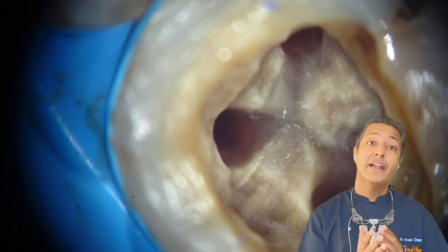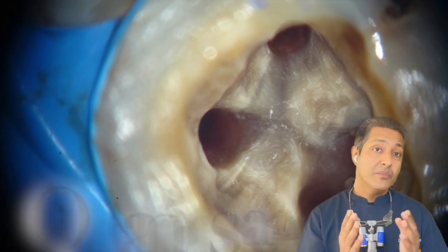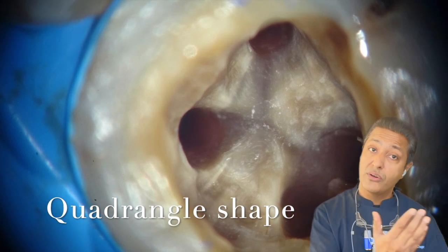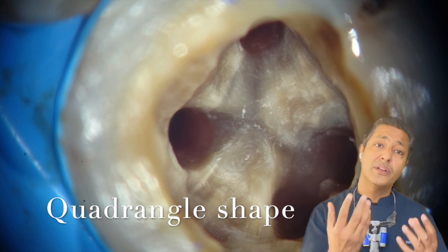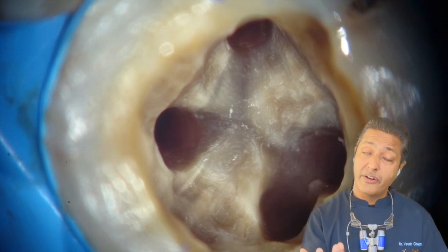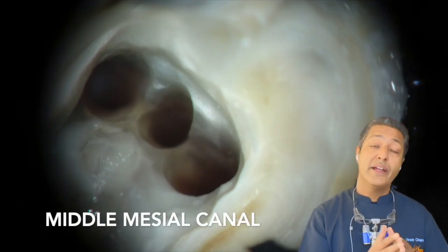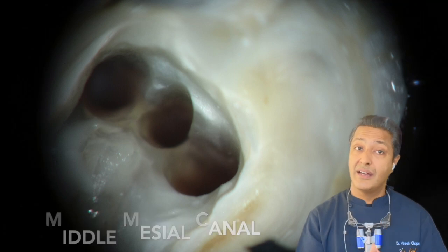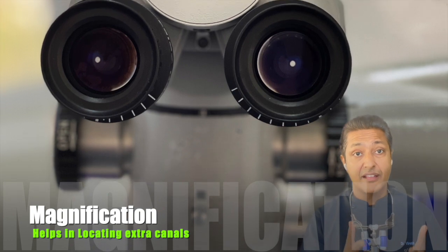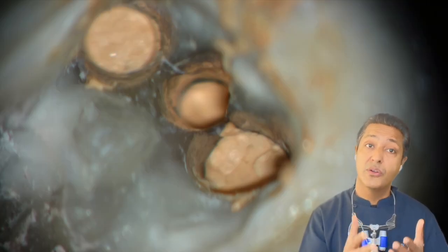However, when we find the fourth canal, the distal second canal, the shape of the access cavity basically changes from triangular to a quadrangular shape, with all the root canal orifices on the corners of this rounded quadrangular shape. There is a chance of finding a third, middle mesial canal if we are using magnification. Research and evidence have shown that many times a middle mesial canal is located.